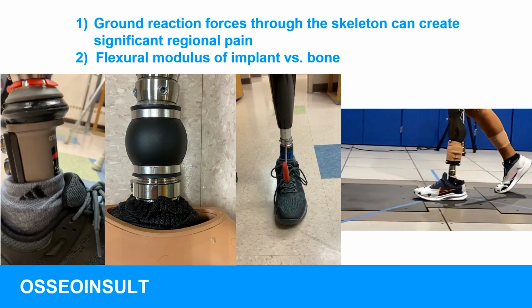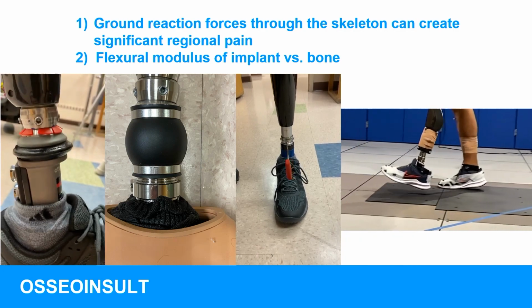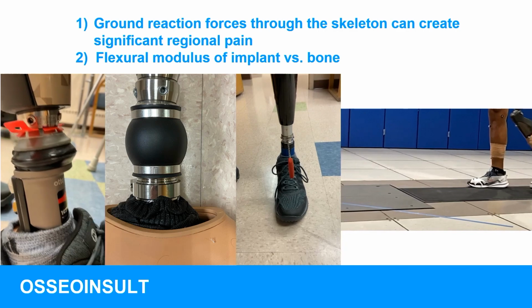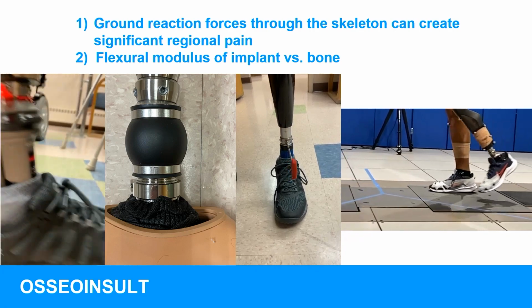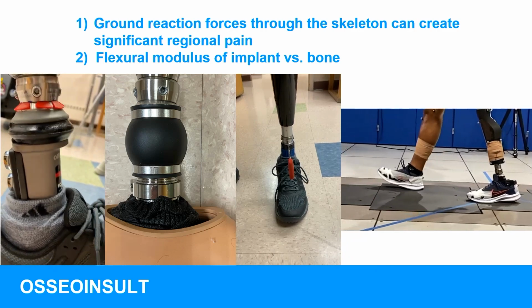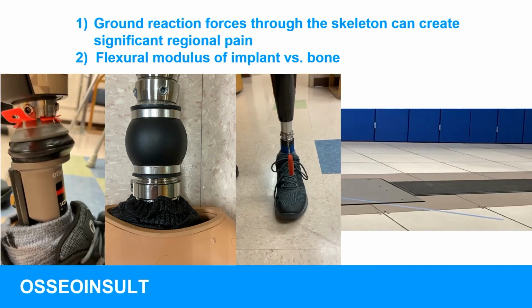Let's try some things." I hate to say this, but a year and a half ago, I never enjoyed working with hydraulic ankles, but we started playing with hydraulic ankles on these patients with vertical shock, and it's amazing that we're eliminating pain in 1 hour to maybe 3 days. Significant pain where they wanted their implant removed is now completely gone.